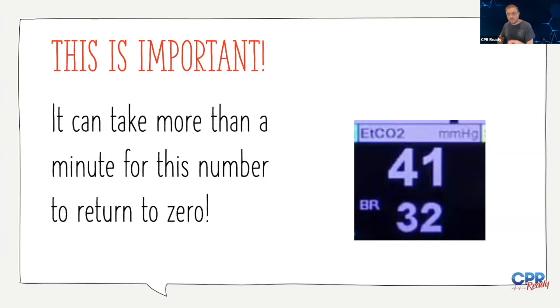So if you're just watching this number on your monitor, this end-tidal CO2, you're not getting absolutely real-time information that's breath to breath. And this number can take a while to change when the patient's condition changes. So if, for instance, you're monitoring an ET tube and that tube were to get dislodged, you might find that this number won't hit 0 for as much as a full entire minute after that tube's been dislodged.